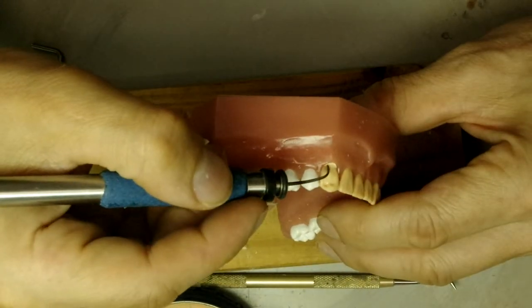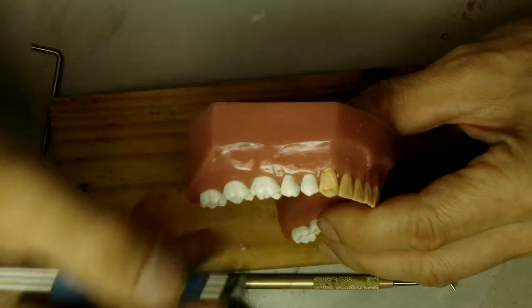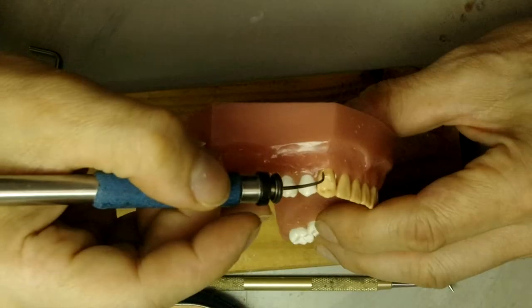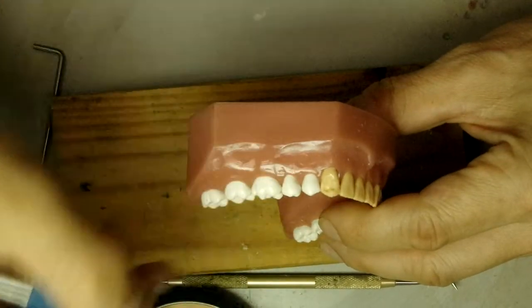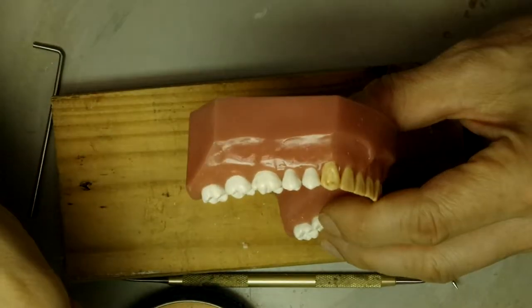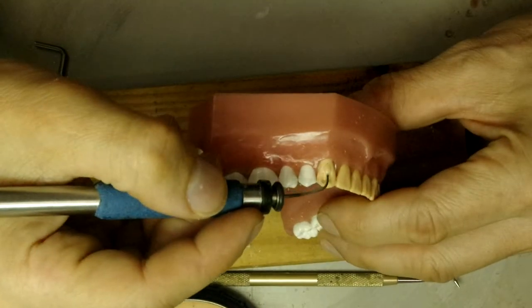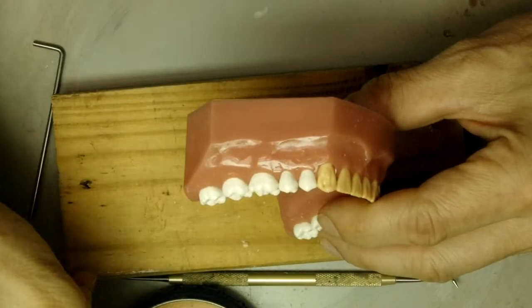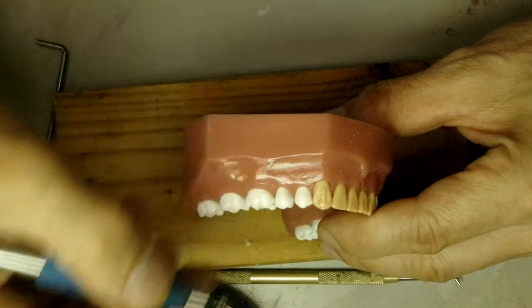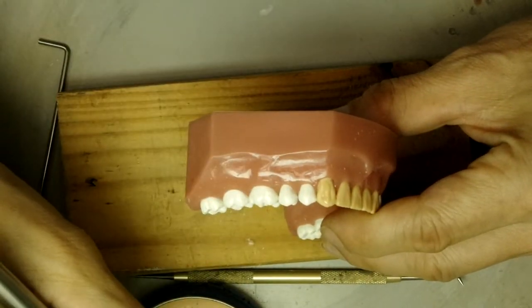Next one is going to be the gingival area, which is what? What is contained in the gingival area? The gingival area contains the height of contour. And the height of contour protects the gingiva from food and overstimulation, and also understimulation.